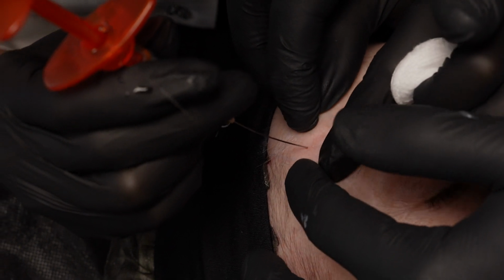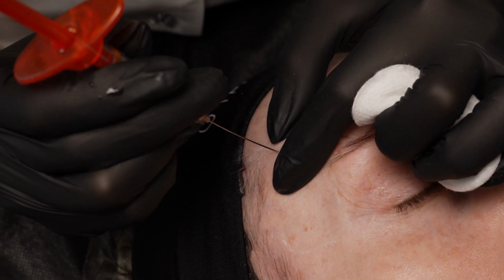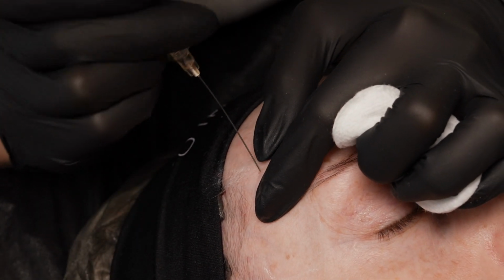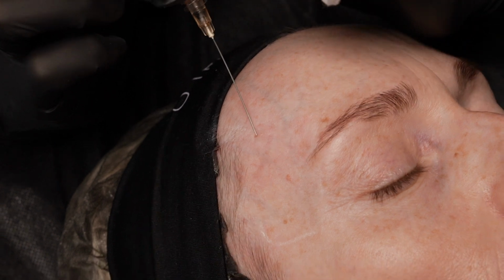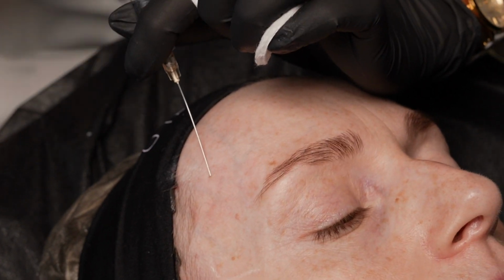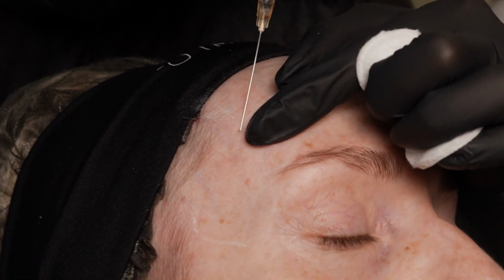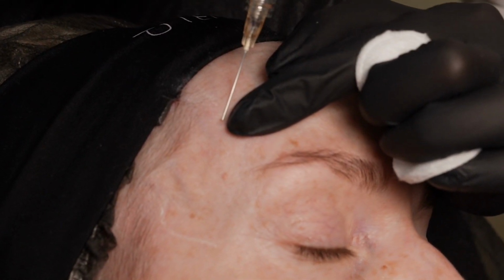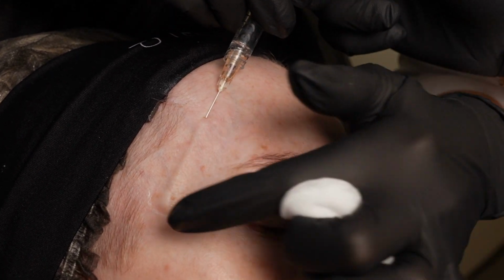You can hold the tissue. If you touch the bone, then slide and go through the tissues. I think I can go a little bit. No, open your way until here. Does it slide easily or not? Yes, easy. Good.